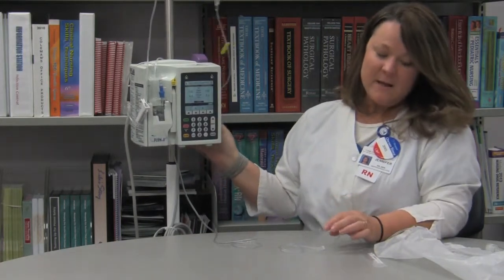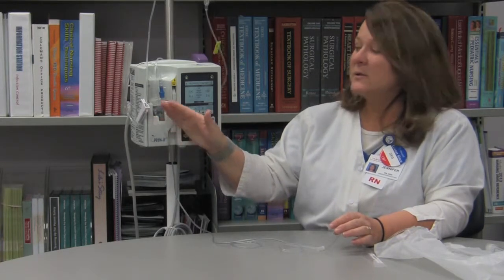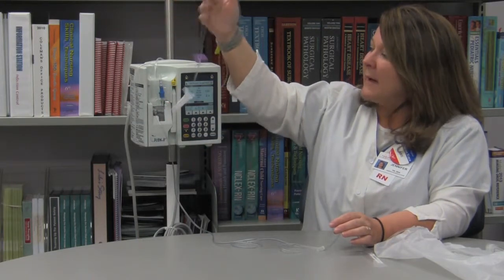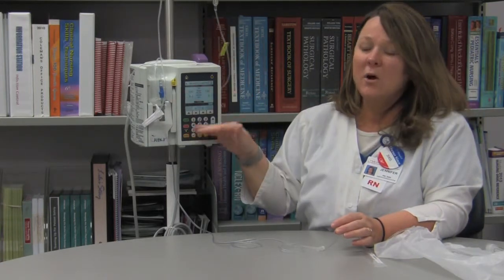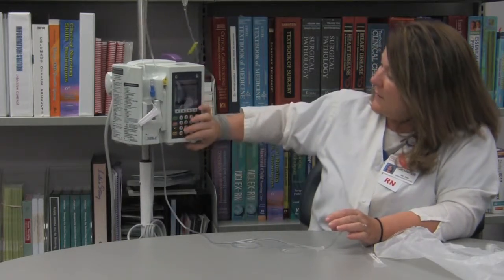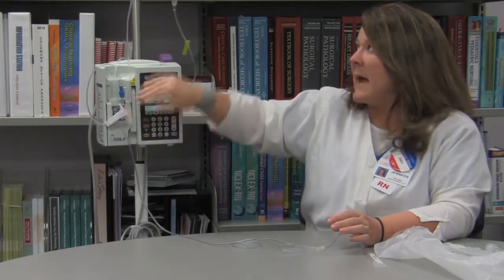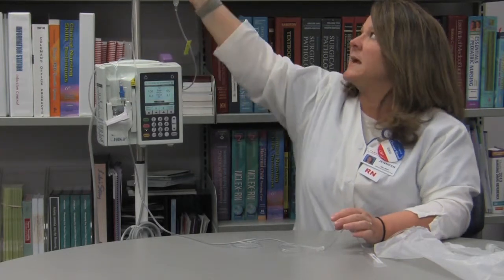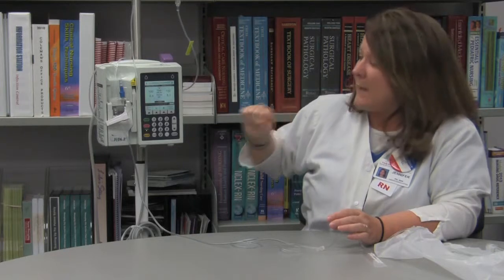Okay. If the pump alarms air, remember at the beginning when we talked about priming the tubing, I said it was very important that you primed it correctly because you can get air in this cassette. If there's air above the cassette from your piggyback or your tubing somehow, this pump will alarm air. If the pump alarms air, you will get a back prime button where you can back prime the air out of the cassette up into your piggyback tubing.